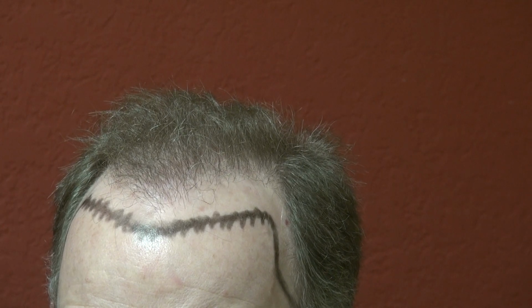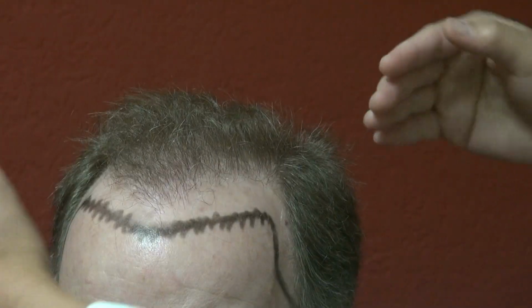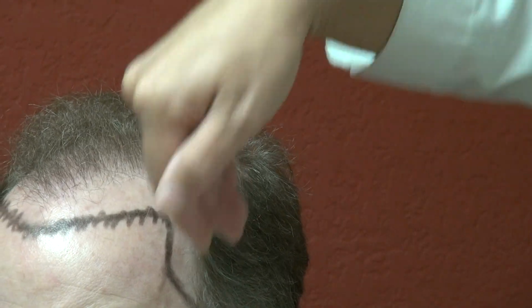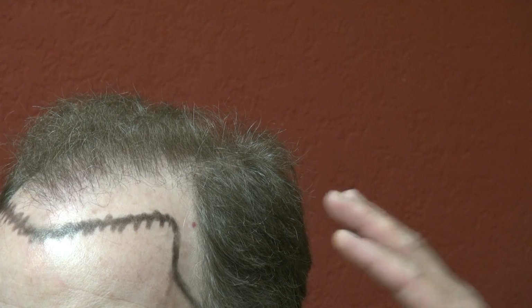Once we get the shape down, I will transplant at a very precise angle. Start around 35 to 45 degrees in the front, increasing as you go backward, and changing when you go in a different direction. For the temple hair, it's flat against the skin and pointed backward. The temple hair is very important. The angle is important, and not only the angle, but the selection of hair graft. The temple is mostly single hair, so we transplant rows and rows of single hair grafts, designed to soften the hairline and frame the face.